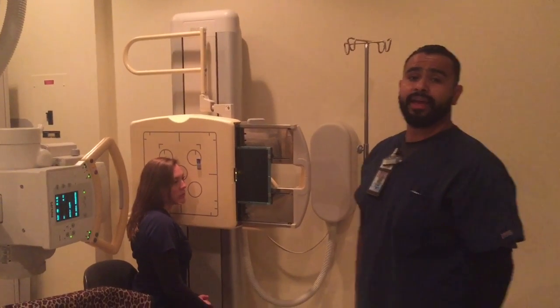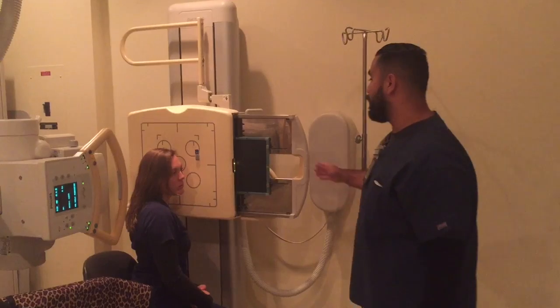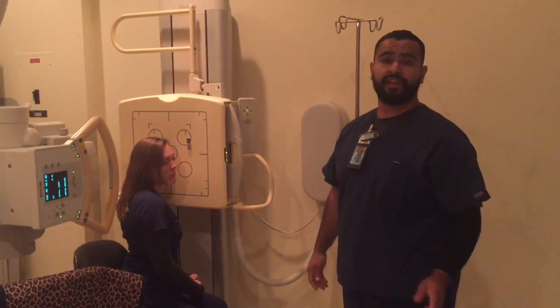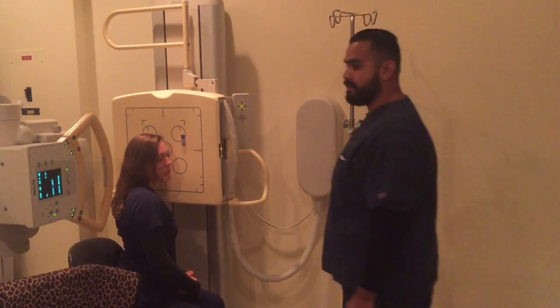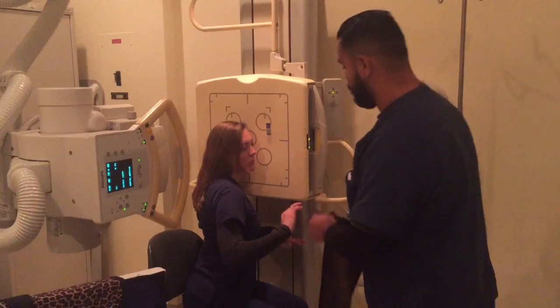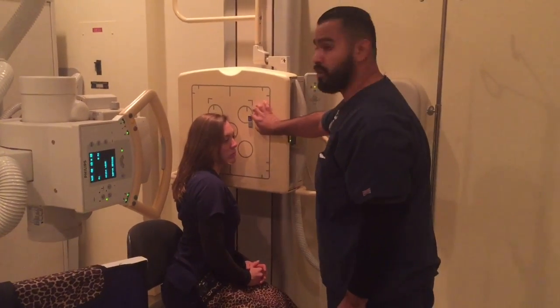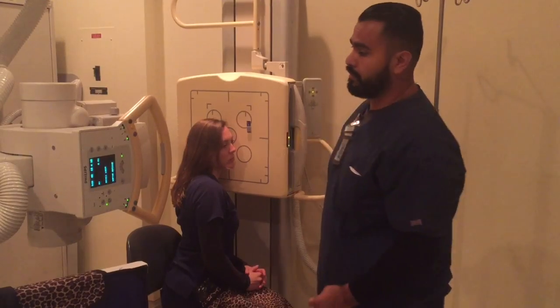So now we'll begin my lateral skull projection. When doing my lateral skull projection, I'm making sure that I have my IR in a 10 by 12 orientation. I have already set my technique to 85 kV, and it could be from about 6 to 8 mAs. Now, I will cover my patient with the lead. You can hold that, please. I have my patient in an upright position with a left marker to indicate that her left side is against the wall bucky.